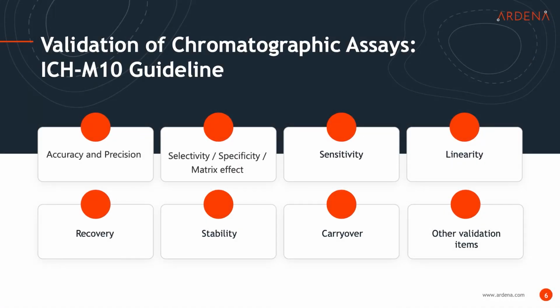The key elements in validation, according to the ICH M10, outline several critical validation parameters, such as accuracy and precision, ensuring that the results are both correct and consistent; selectivity and specificity, confirming that the method can distinguish the analyte from other substances; matrix effects, evaluating how different biological matrices affect the measurement; sensitivity and linearity, determining the method's ability to detect low concentration and maintain a linear response.